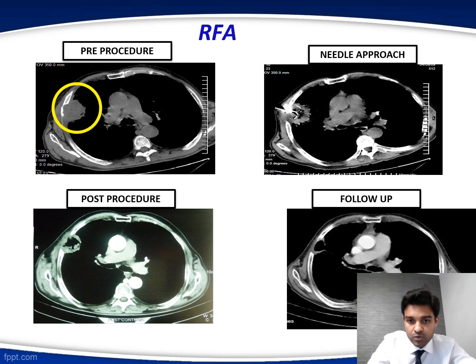Then the needle approach for the RFA was done. Then the post-procedural CT was done, which shows how well it was ablated. Then the follow-up CT at the end showed, after a year or so, how well the lesion had diminished in size.